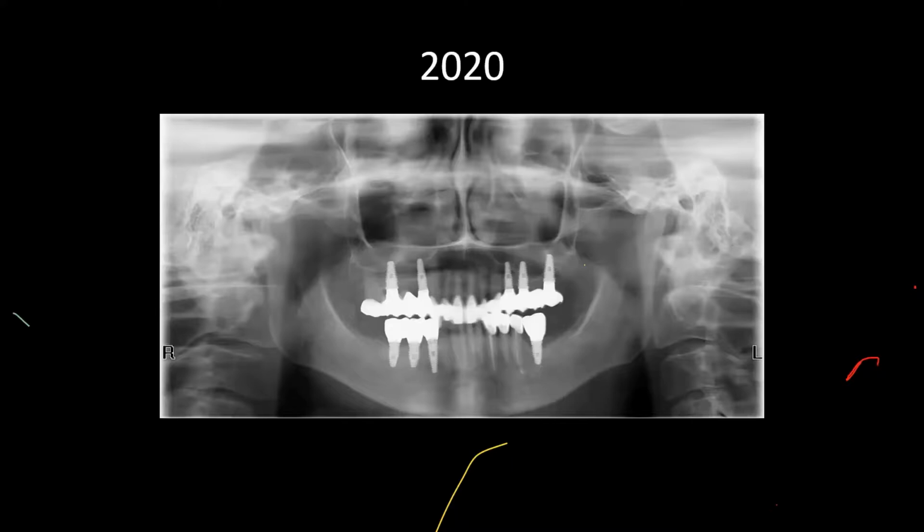from Khan Ravi, yeah. Okay, Khan, the question is, I would ask the patient, here's the issue. I can see some bone adaptation on the lower left 6. Can you see that? There's a bit of bone there, okay? Now, is this a periodontitis? My oral health therapist, Chris, will say no, gums are in a perfect position, okay? Is it loading? Well, we don't really know. I will refine the occlusion.